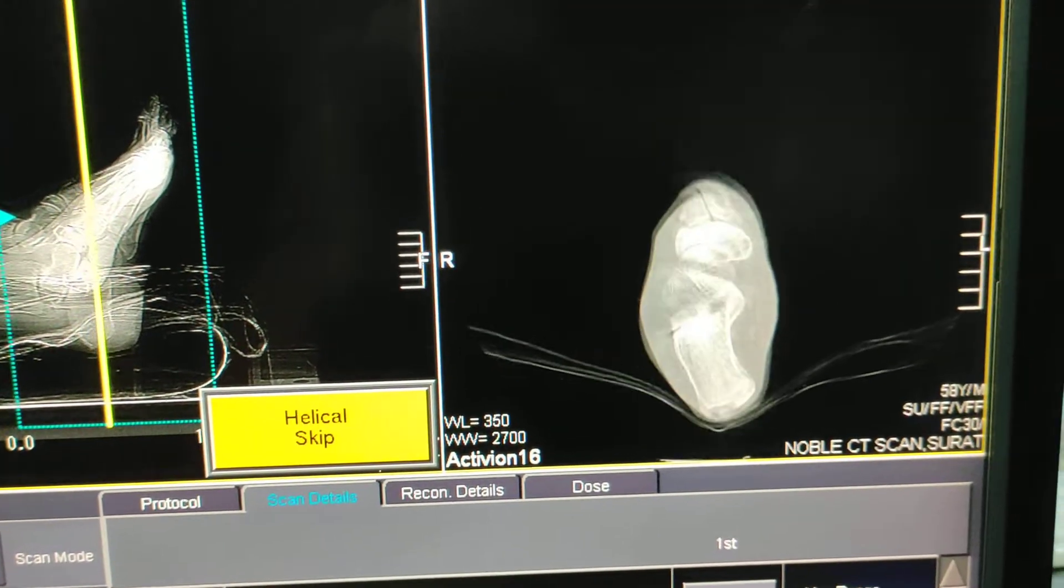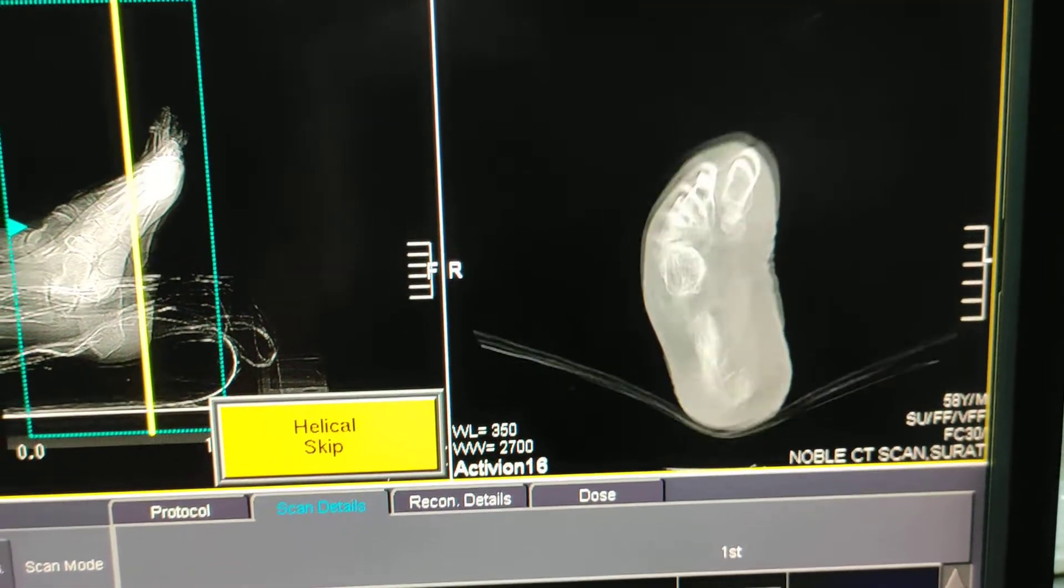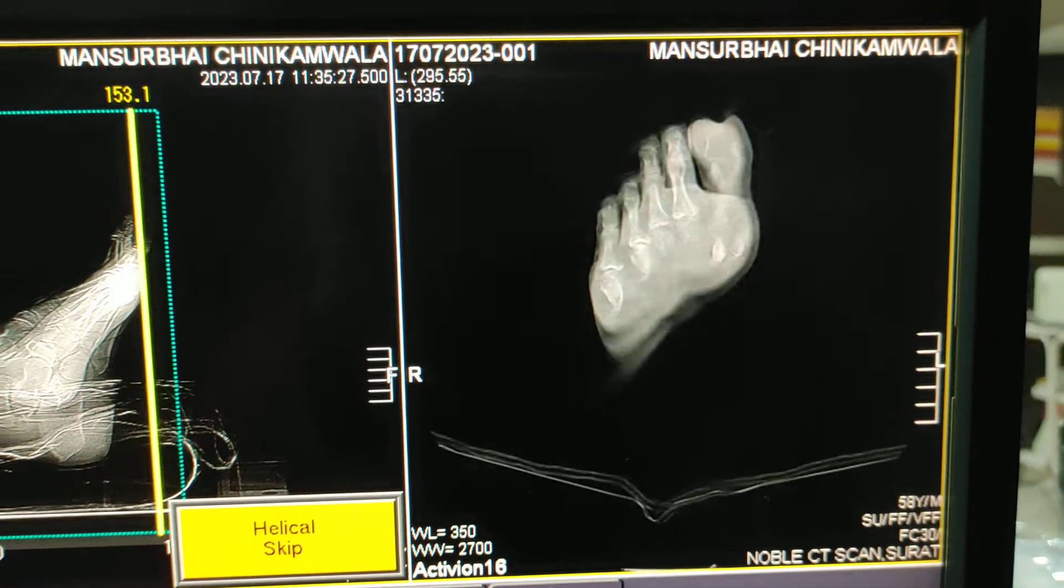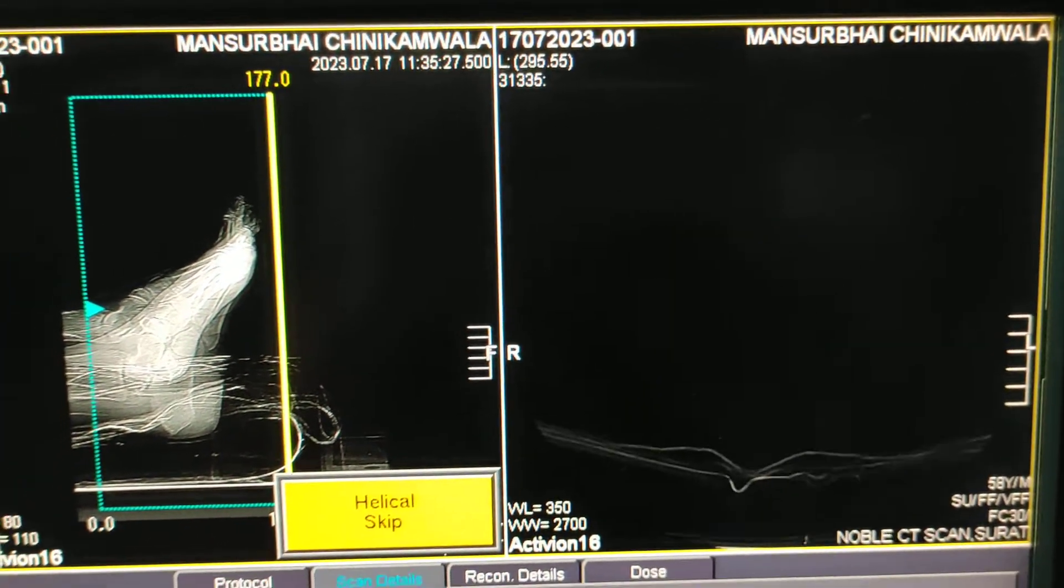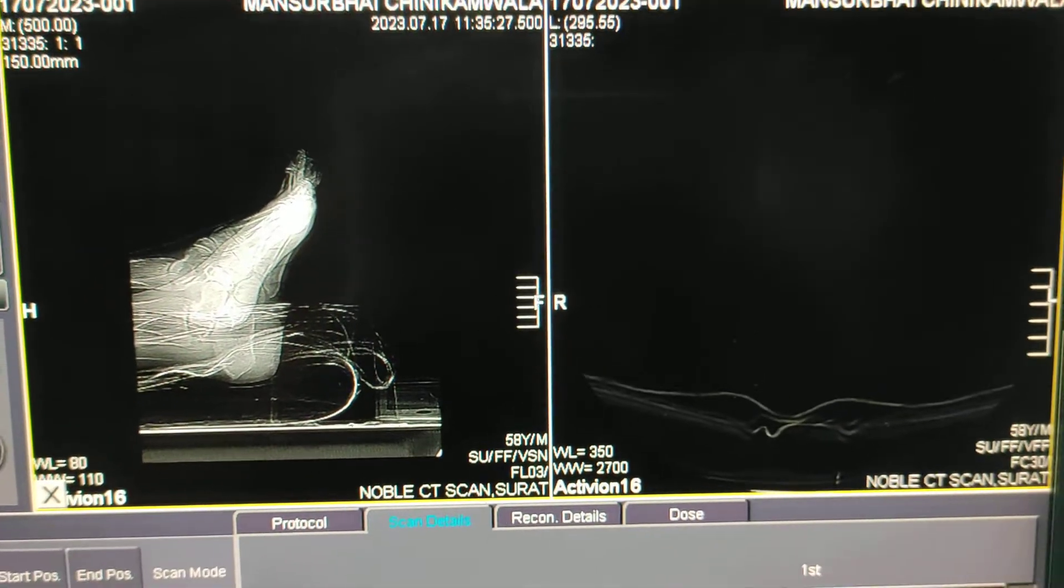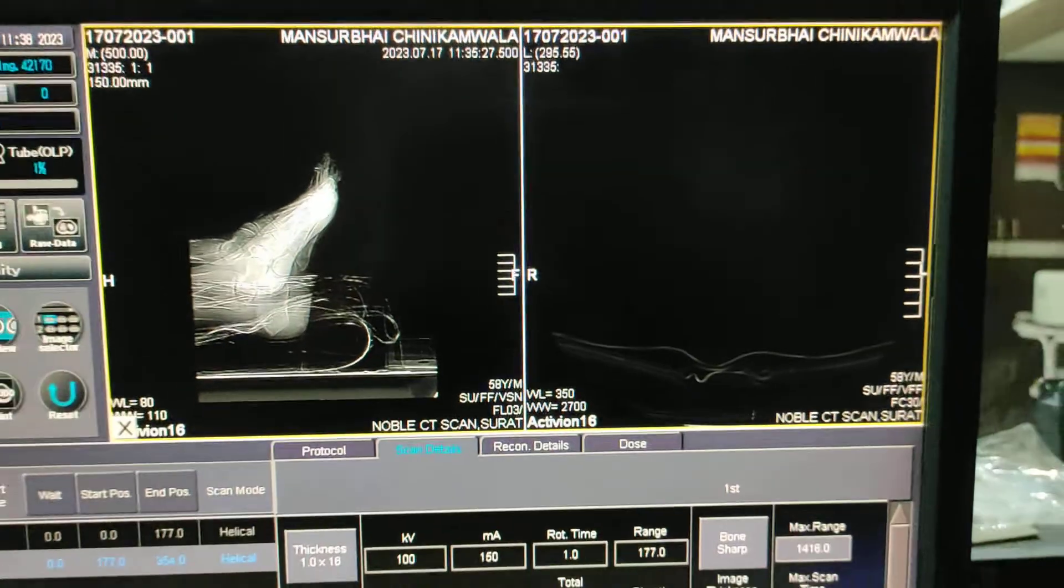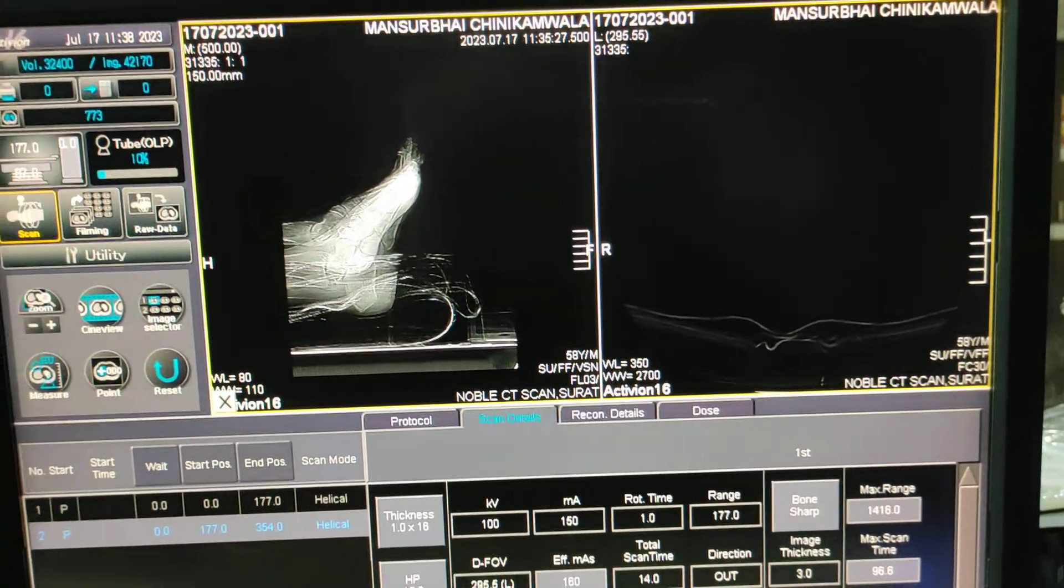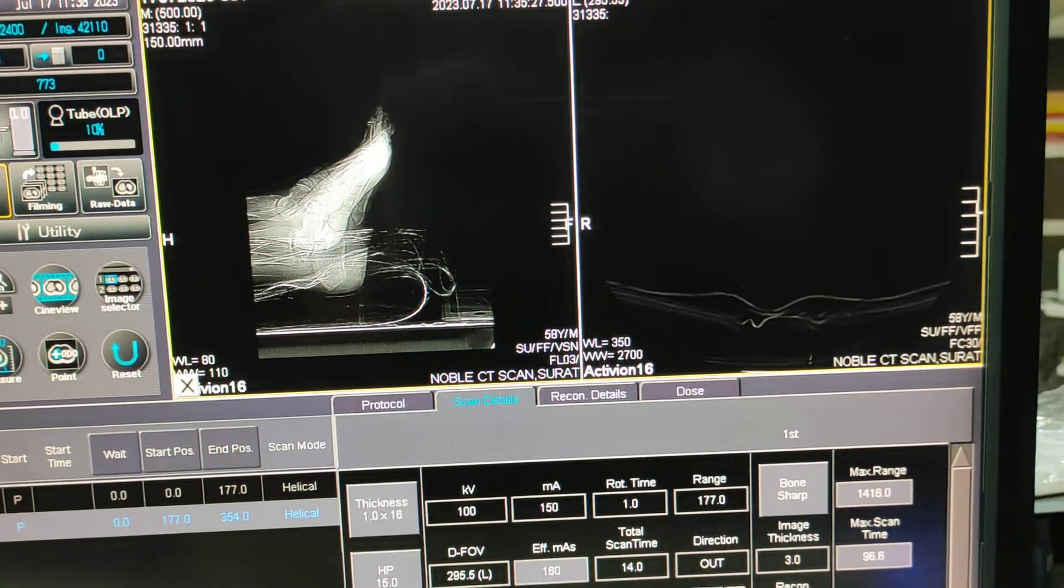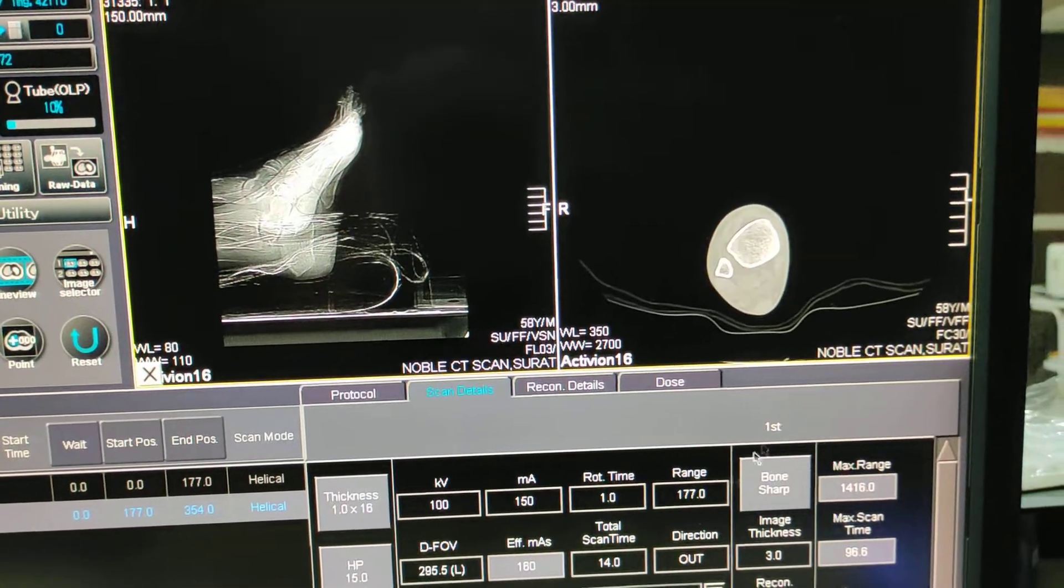Why I am taking from lower end of tibia fibula to foot? Because when you are going for reconstruction, MPR coronal and sagittal, it will give proper images. That's why you have to cover whole of the foot.